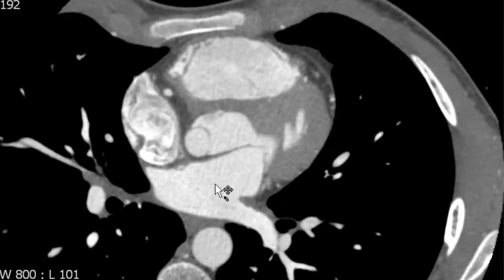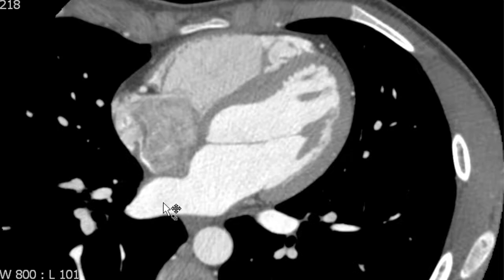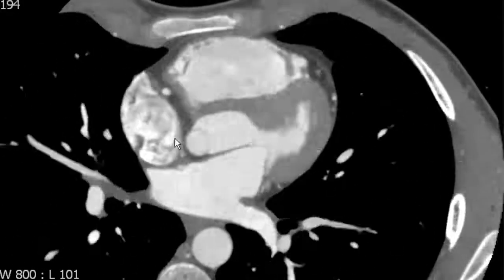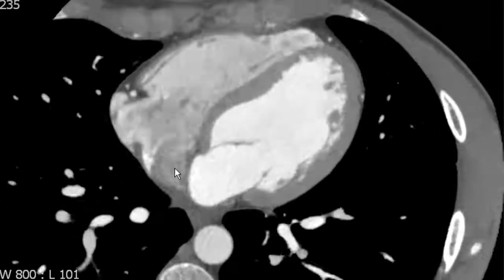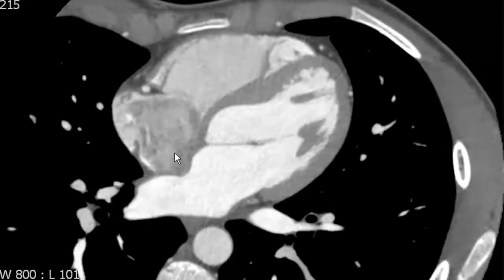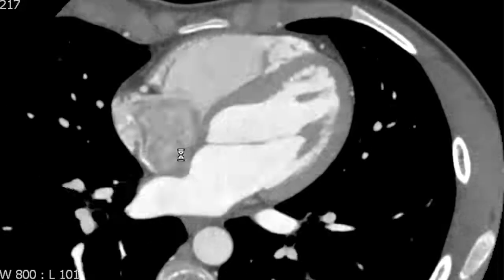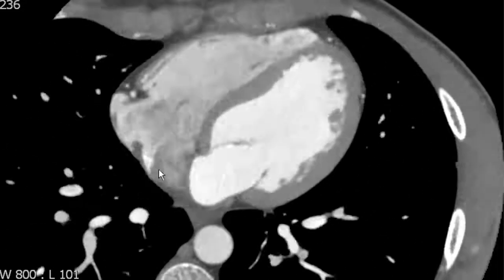The pulmonary veins empty into the left atrium. We can see them on each side there, and we'll talk more about the left atrium in detail in the future. Separating the left atrium from the other atrium is the interatrial septum, and that allows us to identify the right atrium on the right side of the heart.